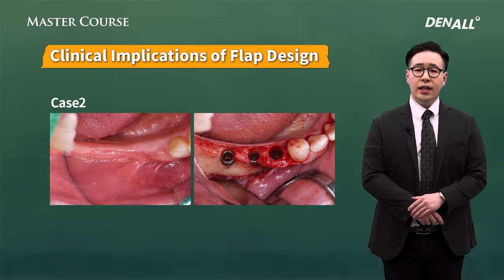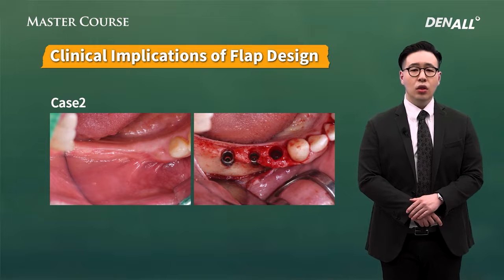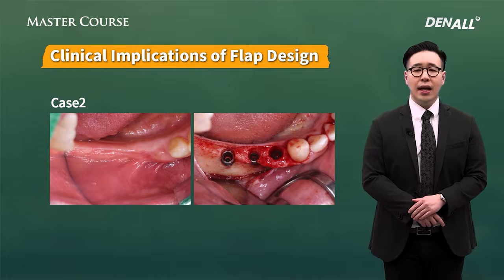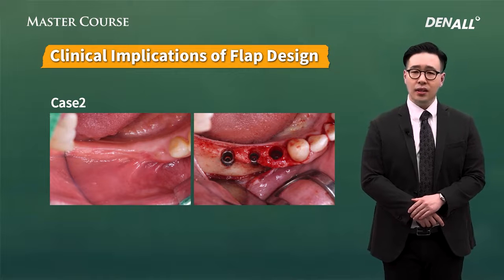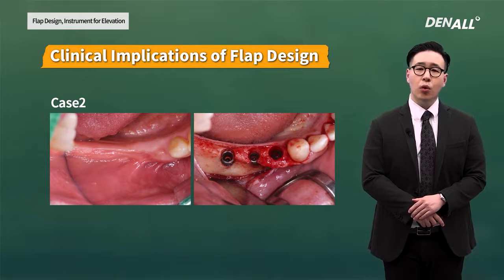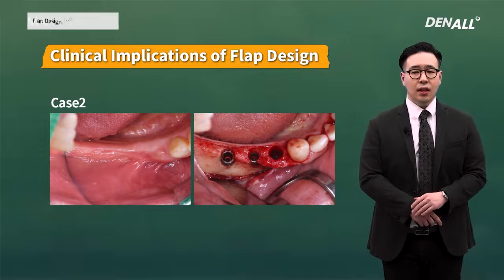For the alveolar crest incision, you need to understand the buccolingual position and the limit as to how much it can be extended, and whether you're going to do vertical incision anteriorly and posteriorly. If you're going to do it, how long will it be? And if there's a bone irregularity, finally, how much keratinized tissue do you have? These factors need to be considered.